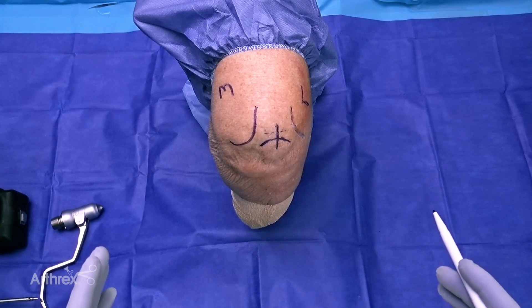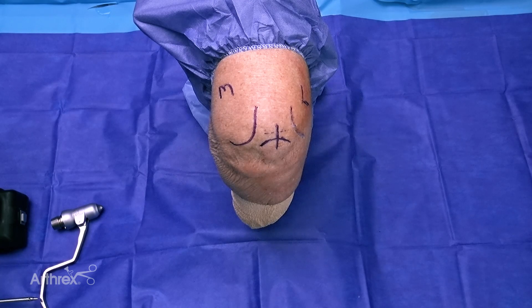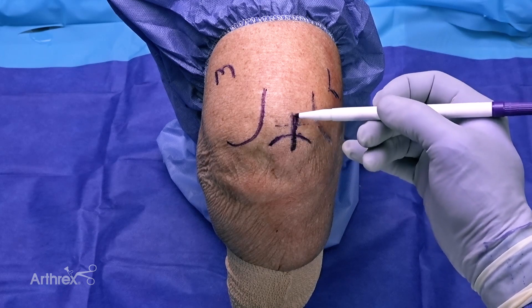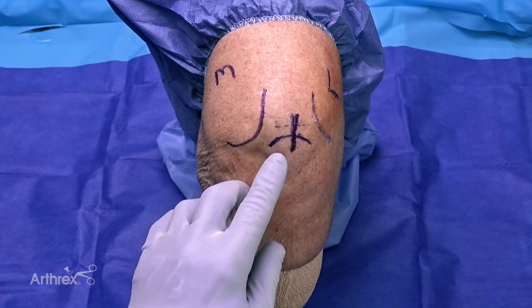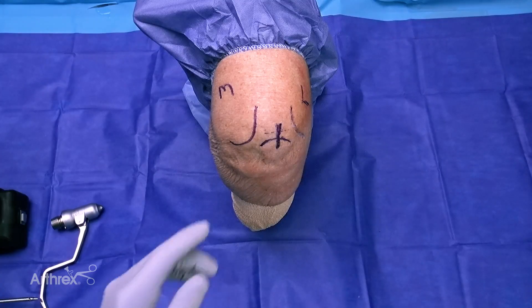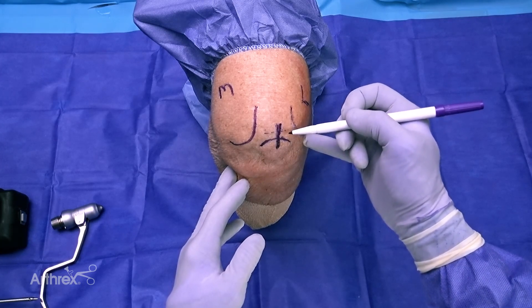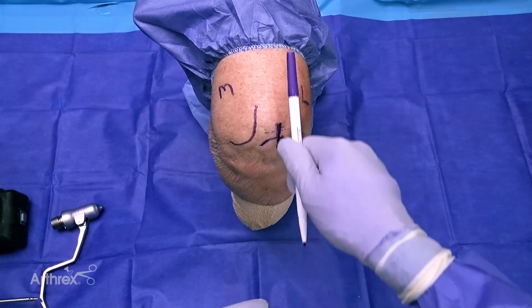This is a real-world situation of what it looks like getting ready to harvest a quad graft. There are two different types: bone quad tendon, or BQT, and all soft tissue. For a bone quad tendon, I make a vertical incision incorporating part of the superior pole of the patella and about 1.5 centimeters of the distal quad tendon, enabling access to harvest a bone plug while also accessing the quadriceps tendon. For soft tissue only, I hide a transverse incision in Langer's lines proximal to the superior pole of the patella, which gives the proper angle with the cutting guide as I go up the proximal femur.